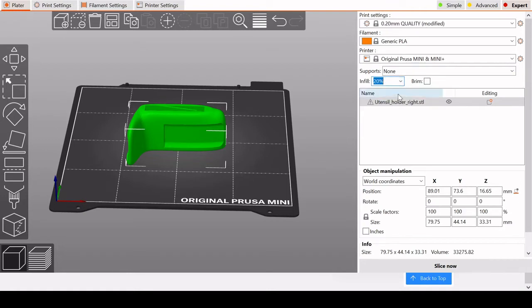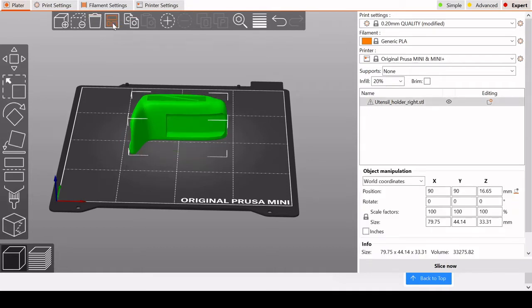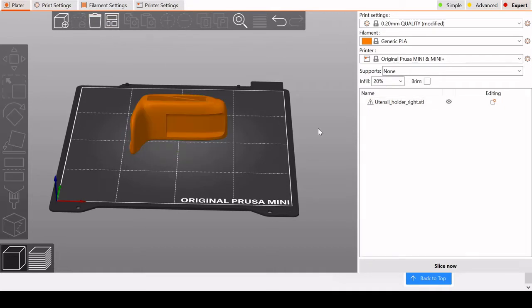Next, you'll want to choose an infill percentage. This effectively determines how much of the inside of your print is plastic and how much is air. By selecting 20% infill, I'll have roughly 20% of the inside composed of plastic in a pattern that I select. The larger your print and the higher the infill percentage, the longer the print will take. While having more infill generally makes for stronger prints, there are diminishing returns around 50% infill. For most of these prints, I would recommend a gyroid or cubic infill pattern just for the strength component of it.